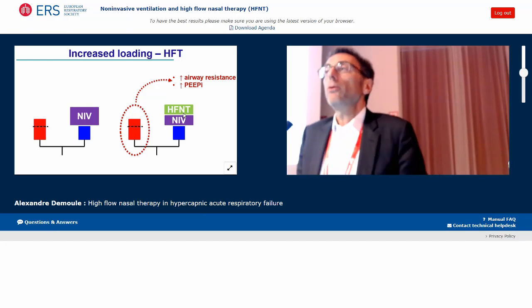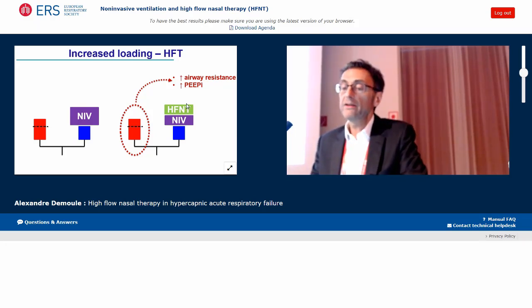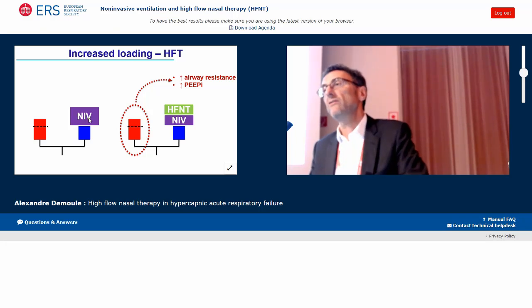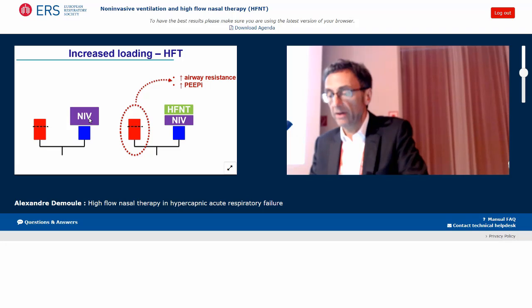So the purpose of this talk is to discuss the interest of combining high-flow nasal therapy and non-invasive ventilation instead of using only non-invasive ventilation. It's not like replacing non-invasive ventilation by high-flow. It's giving high-flow and non-invasive ventilation. And there's a rationale there for using high-flow.